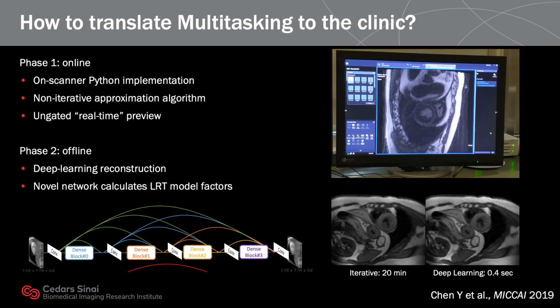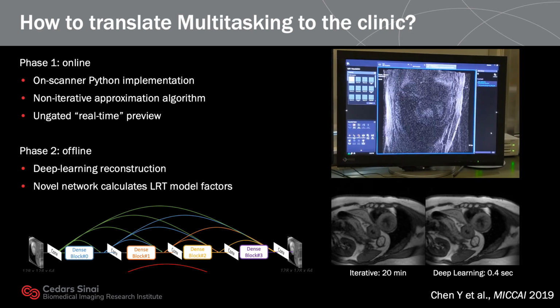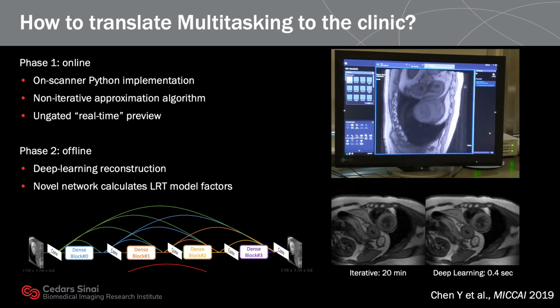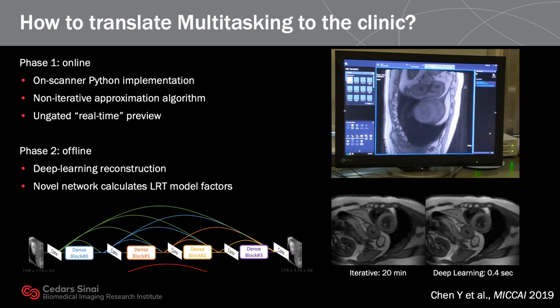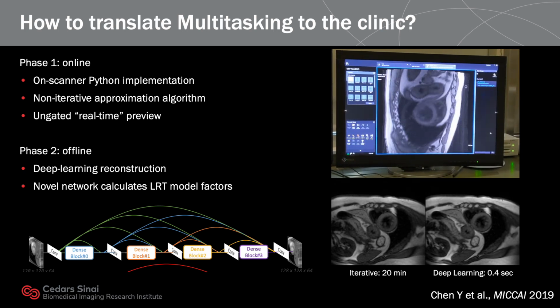In this presentation, I have shown briefly a number of potential applications of multitasking in different parts of the body. Obviously, more patient studies are required to evaluate its clinical value. A practical limitation for large clinical studies currently is a long image recon time.